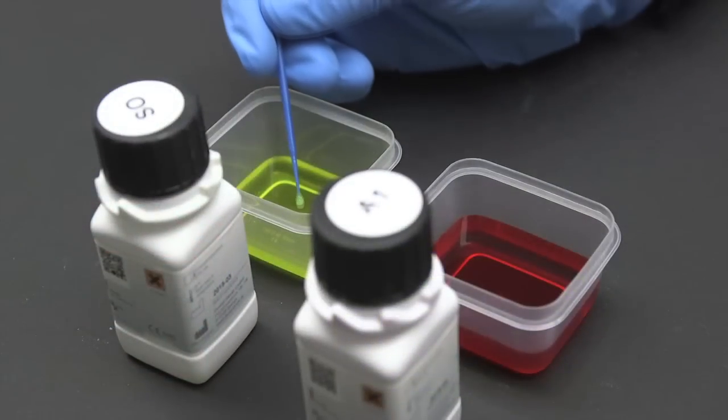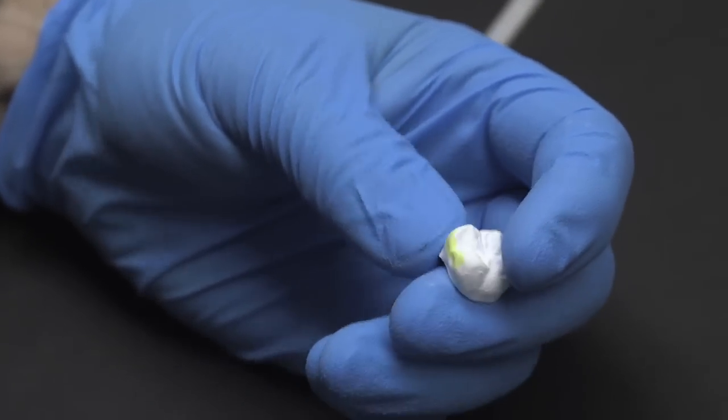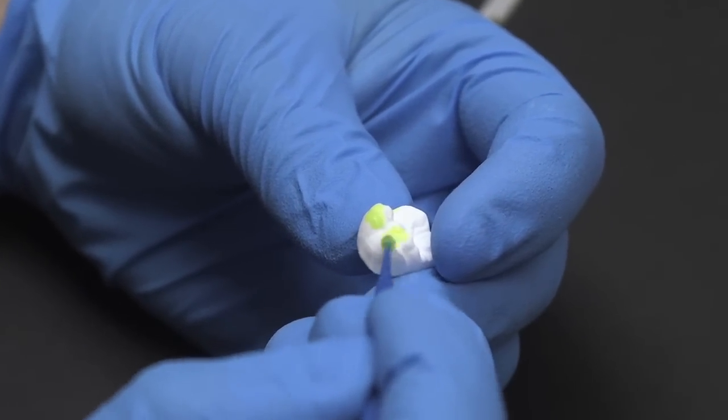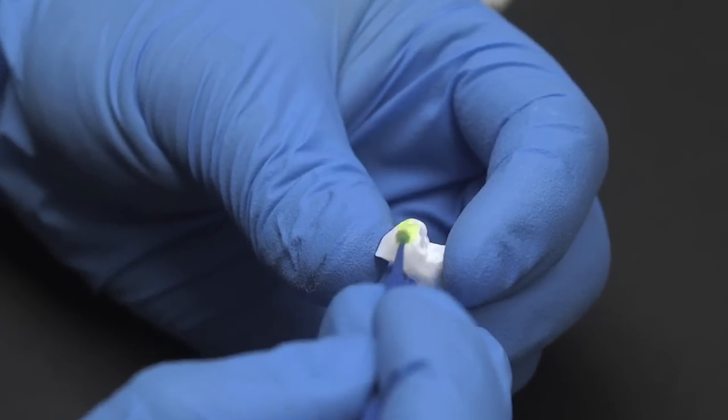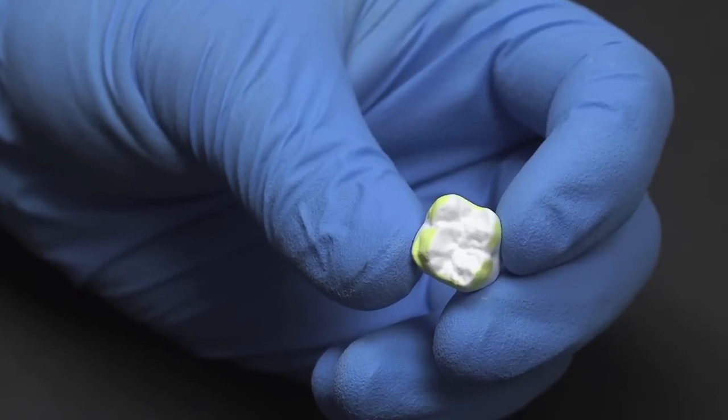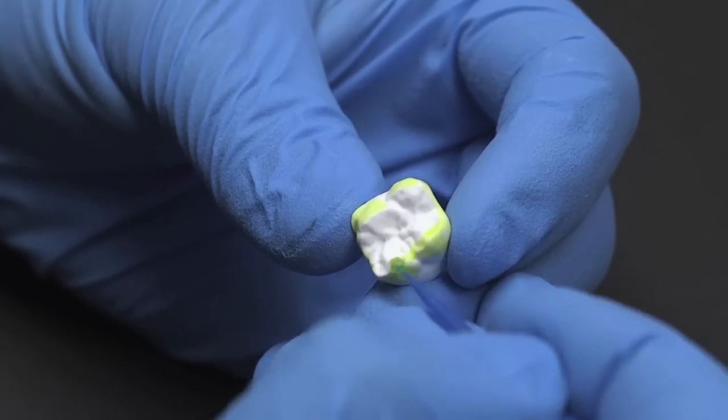You first want to apply the incisal liquid to any areas where less Denton color saturation is desired. When processing a posterior crown or bridge, paint the cusp tip with the incisal liquid. When painting the incisal liquid on an anterior crown, apply to both the facial and lingual incisal areas.